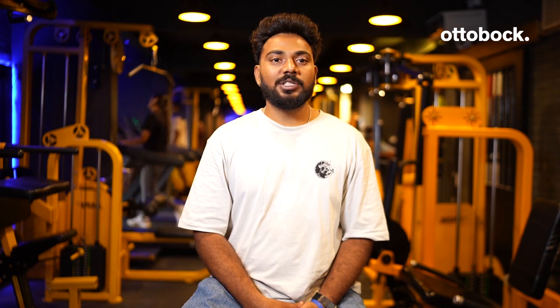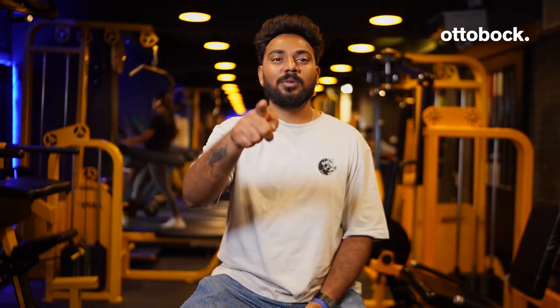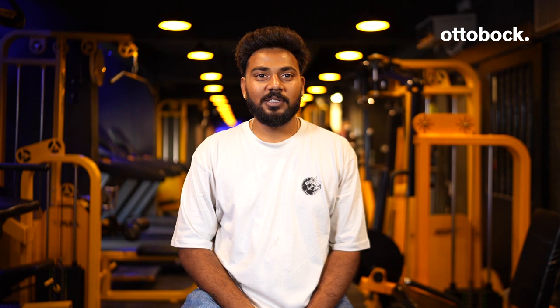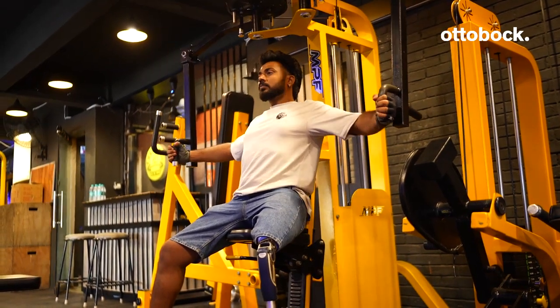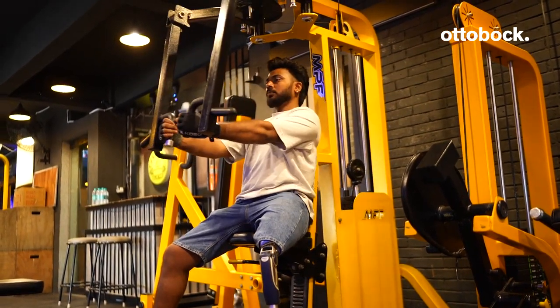Do you want to start gyming with a prosthetic leg? I have some tips for you. First, check with your prosthetist whether your prosthetic technology is gym friendly, what the maximum weight limits are, and if there is any activity you should not do. For example, I use a 3R80 swing and stance control hydraulic knee, which has a weight limit of 150 kg.